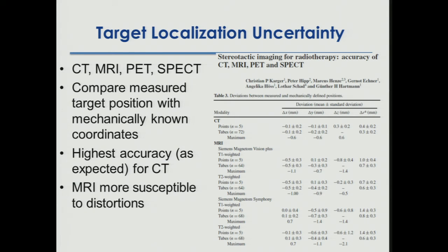But we need to pay attention that this MRI is well shimmed and well maintained to not have distortion. I've seen distortions of up to 2 millimeters over the range of a cranial MRI at a very well-known institution on the West Coast. So think about that if you use MRI. Ideally, we usually don't know how radiology QAs their MRIs. We often do not know in larger institutions who the physicists are. My recommendation is to go seek that physicist out, invite him or her to lunch and have a talk about this, because you need to know this.